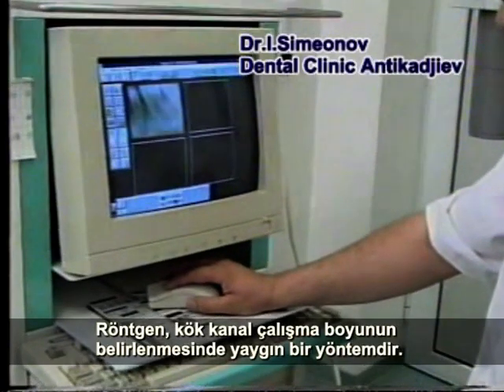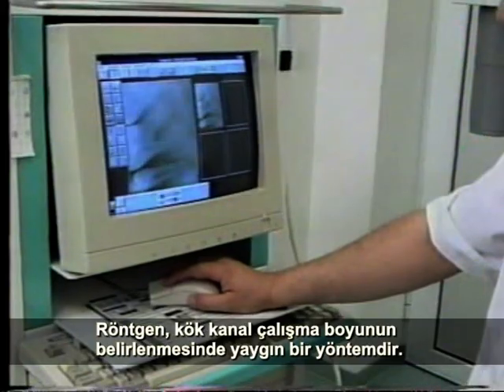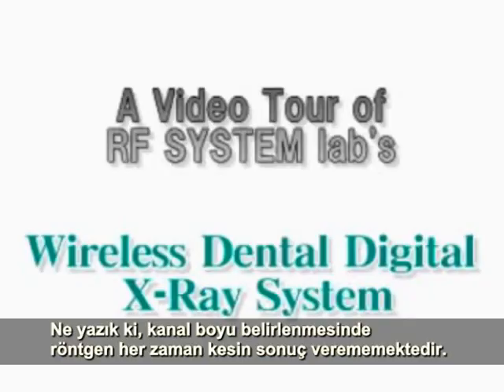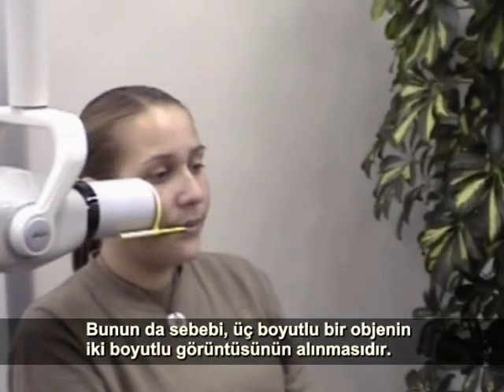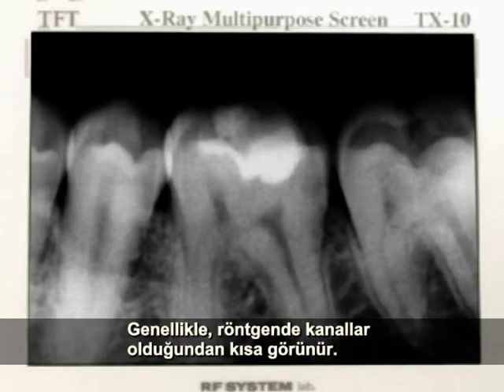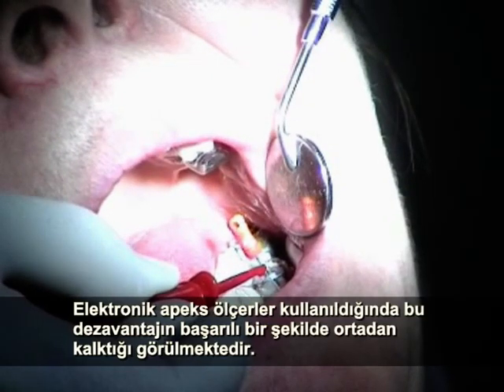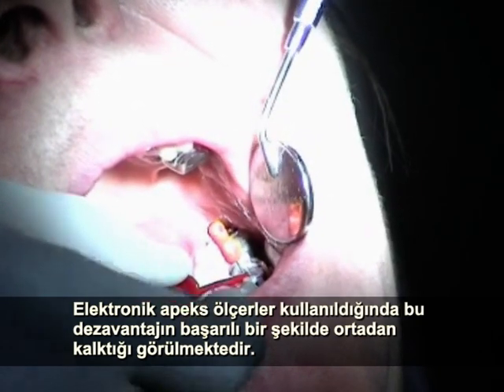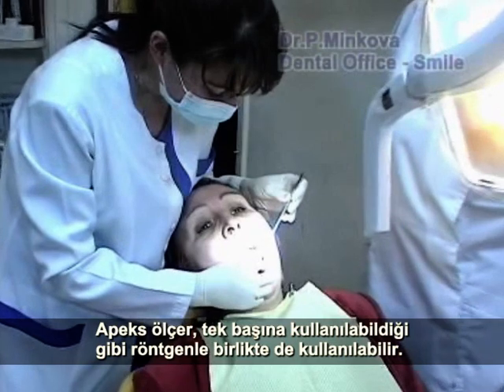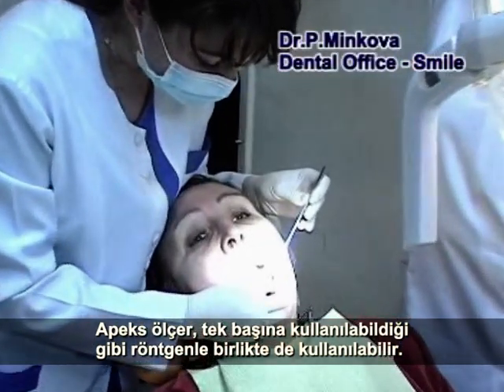X-ray testing is a common method of determining root canal length. Unfortunately, the X-ray determination of canal length is inexact in most cases because of the two-dimensional image of a three-dimensional object. Usually, canals are determined as considerably shorter. The disadvantage is successfully overcome using electronic Apex locators. They can be used either independently or in addition to the X-ray methods.